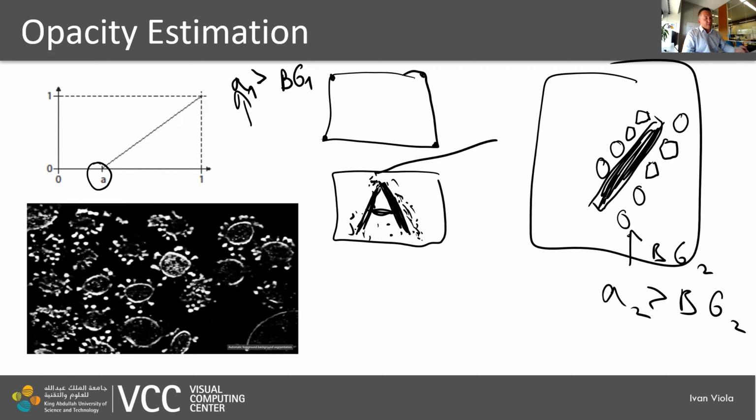At some point we are satisfied with the representation of our threshold, and this is how we estimate the threshold value A for each of the slices. Then we create an average value of A so that we have one A parameter for the entire volume. This is how we create the opacity transfer function, which is a very simple one, but it is simple because we have already done the tough part of interpretation in the soft labels segmentation.